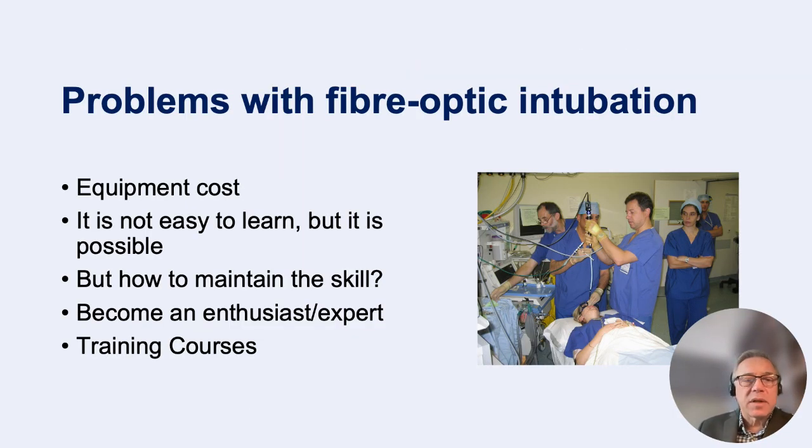What are the problems? Equipment costs money. It's not easy to learn, but it's possible. I think I've done a few thousand so far in my career, having done it regularly and obtaining the relevant list. But the problem comes after you've learned it. How do you maintain the skills? You need to become an enthusiast, and then you become an expert. So you need to pick up a relevant list, maxillofacial, ENT list, and then we run several courses, which I don't have time to tell you about.